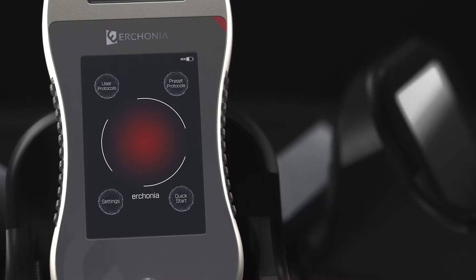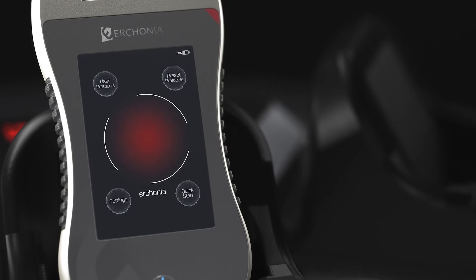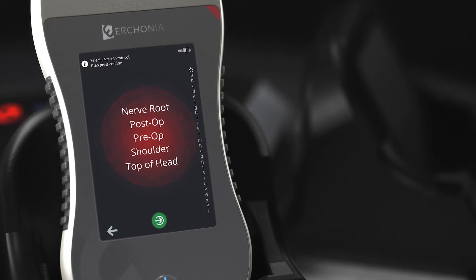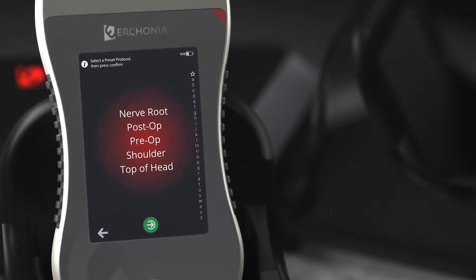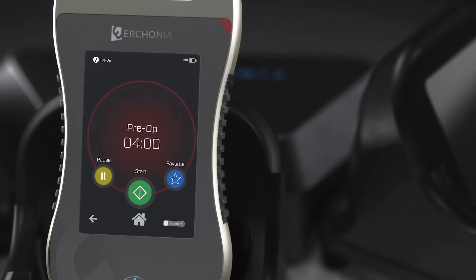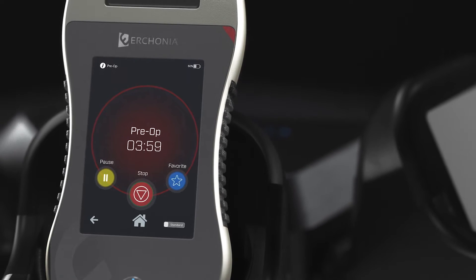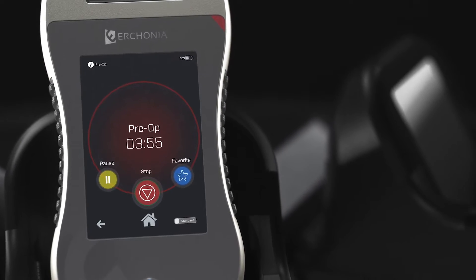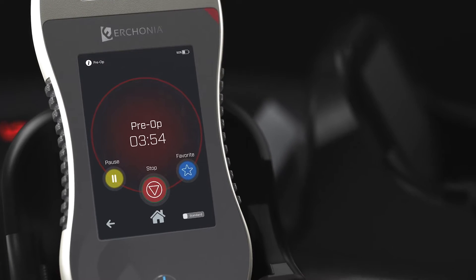Next let's take a look at the preset protocols. This will list all the protocols that have been FDA cleared to be treated with this device. To run a protocol, simply touch it and press the green button, then press the green Start button and the lasers will initialize. Just like in the other mode, you can pause, resume, and stop.